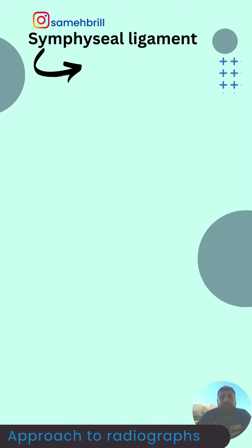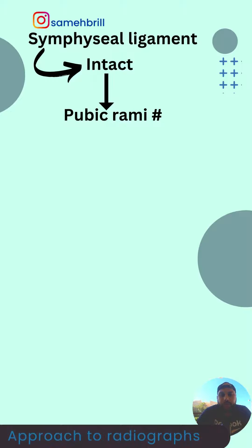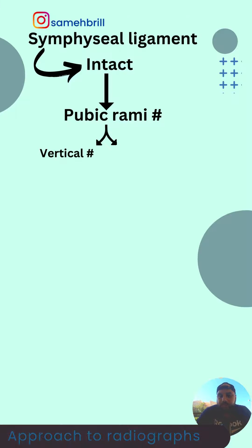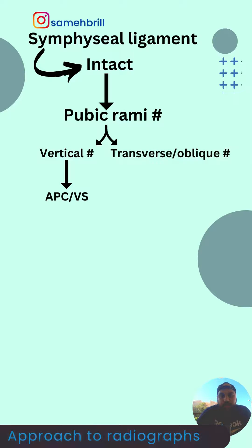Now if the symphysial ligaments are not disrupted, I'll go for the pubic rami to check if there is any fracture. If there is a vertical fracture, that might be an APC fracture or a vertical shear. If it's a transverse or oblique fracture, that might be an LC fracture.